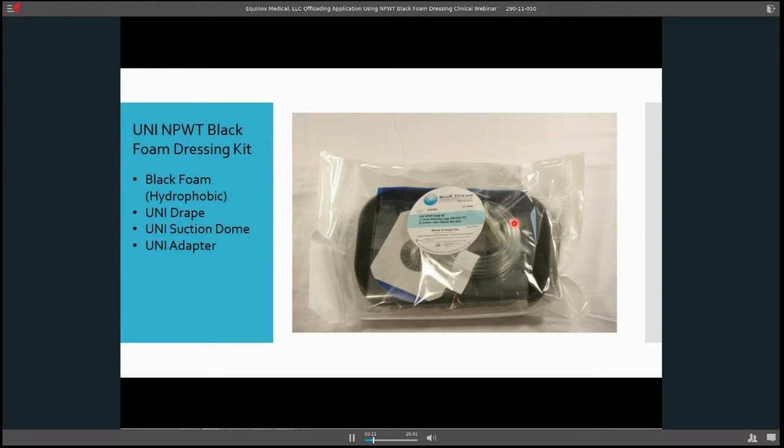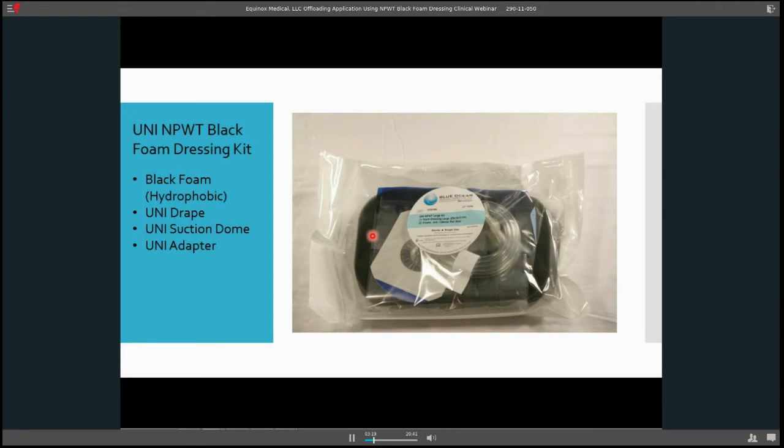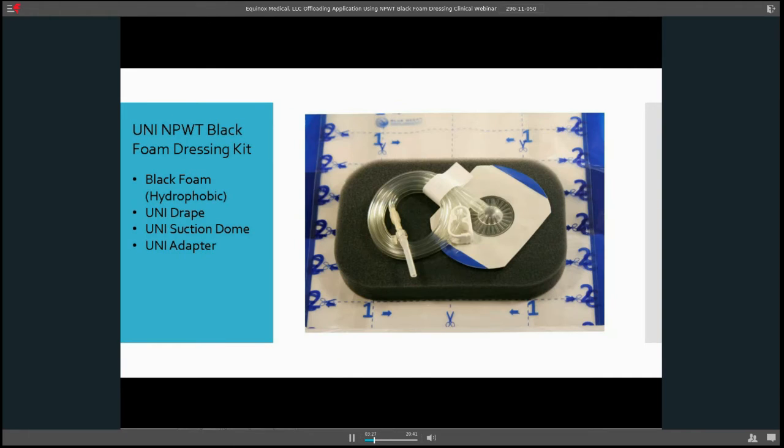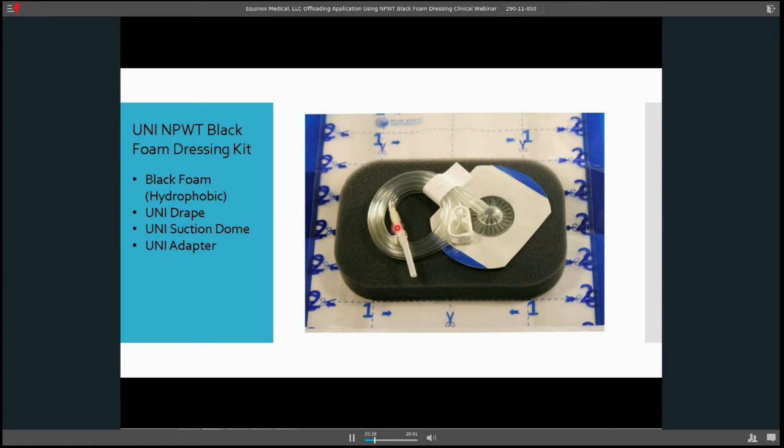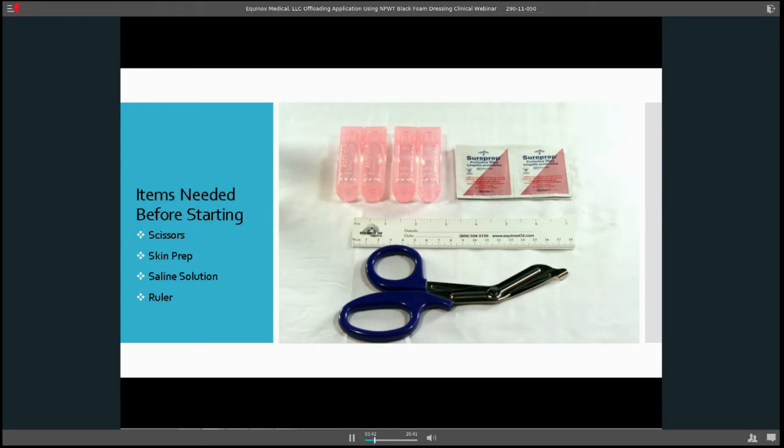So I want to show you here, the black foam kit is a sterile kit. It comes with your black foam, which is hydrophobic, meaning it does not like water. It comes with the uni drape, 1-2-3 uni drape, a suction dome, and a uni adapter. Here is everything in the kit. You can see the 1-2-3 drape, which is very easy to cut, the black foam, here's your dome, and here's your adapter kit.